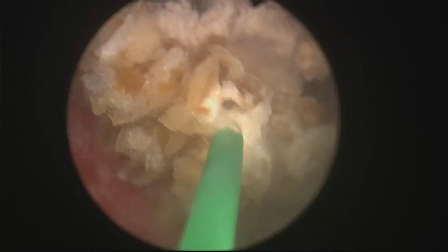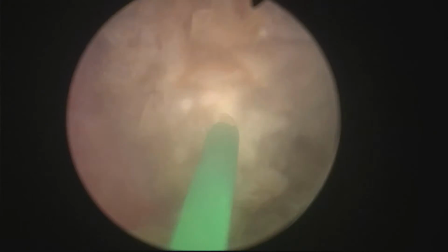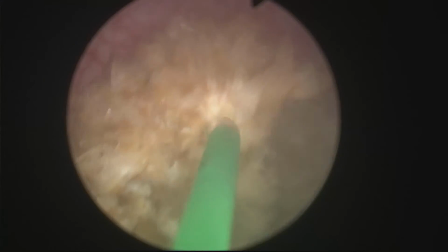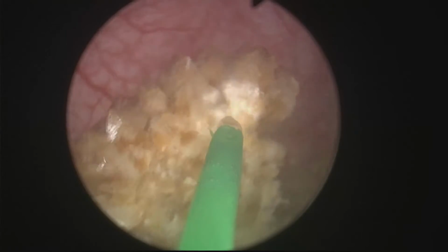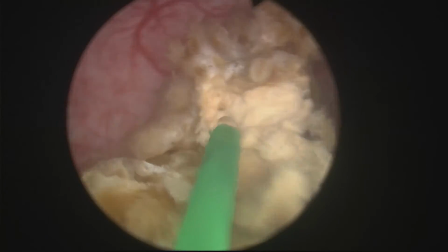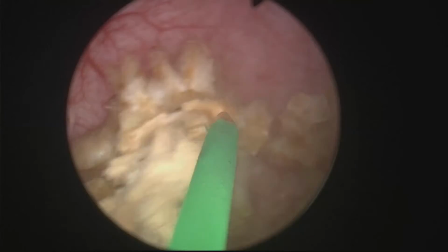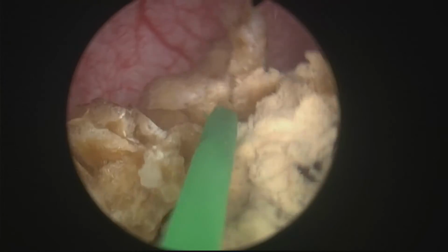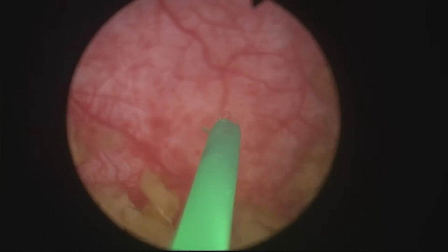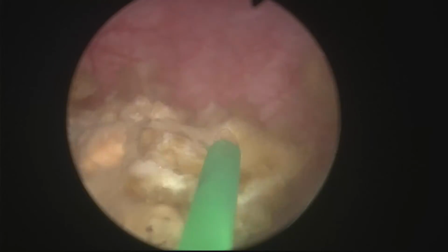So I thought it was a quite interesting case to show, not only because of the stone and the cause of the stone, but also because I love these redo cases. I think they're very interesting. And also I think it's amazing how we can treat these cases perfectly with the en-bloc approach.